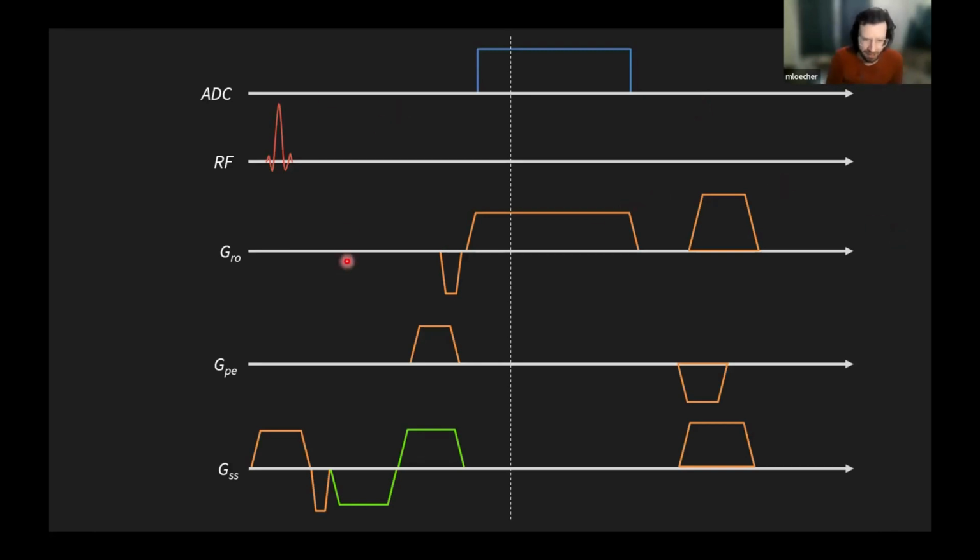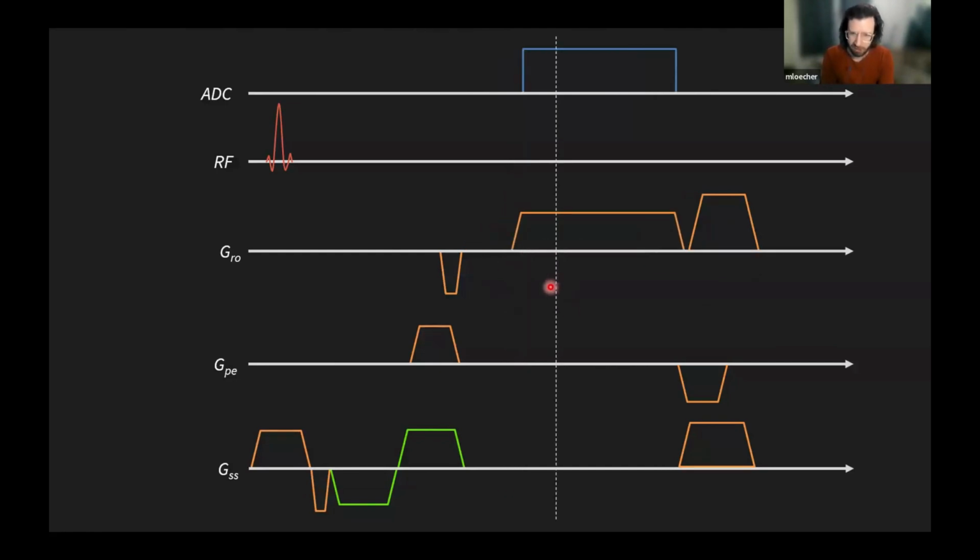So what this looks like, once again, is the same sequence I've been showing, standard SPGR, with the bipolar gradients here. Basically, the only variation in this experiment compared to a standard phase contrast exam is that the TR is a little longer to make a big gap here in the readout area. And then we keep running the same scan over and over, but just shift the readout. So we have an image at a bunch of different TEs. We end up doing about 40 TEs here, all only about 40 microseconds apart. So it's lots of images with slightly different TEs, but all the same other timings.